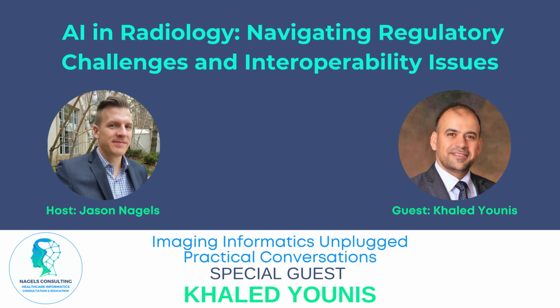So there we focus more on privacy, security standards, HIPAA, and standards like 27001, and that's how we can look at the parallels between IHE and ISO, where everyone is trying to shape the adoption of AI and ensure we're doing it in a proper way.